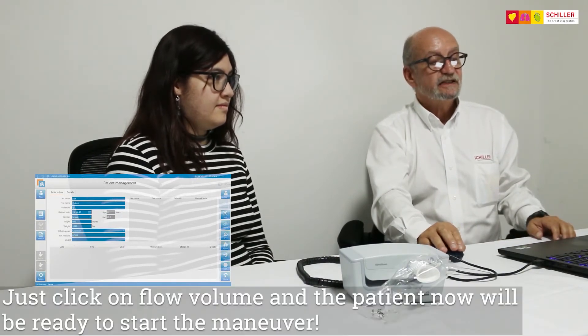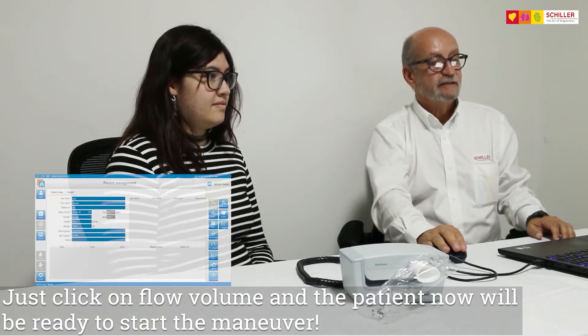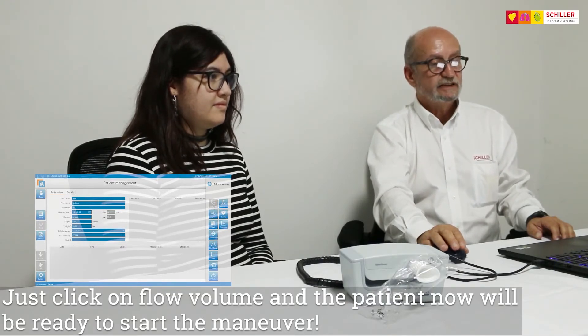Then just click on Spiro — flow volume. And the patient will now be ready to start the maneuver.